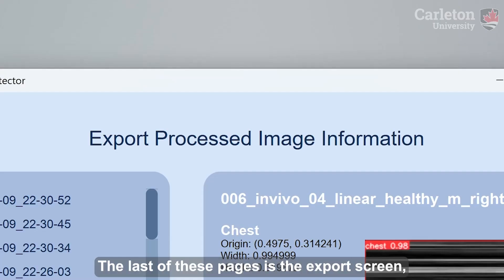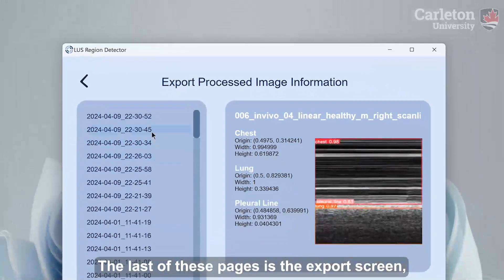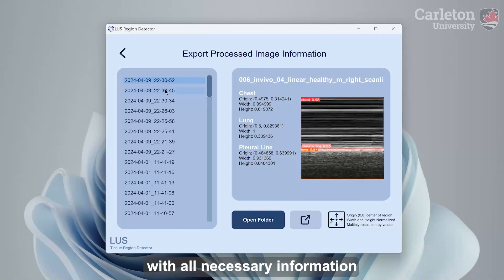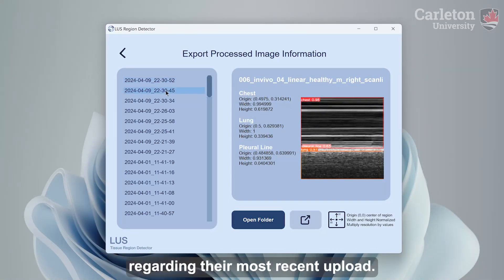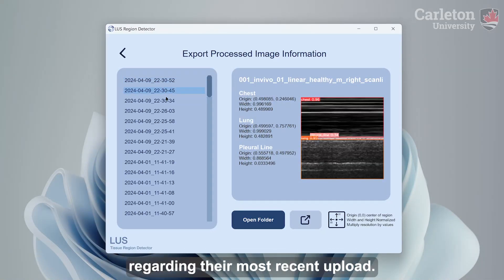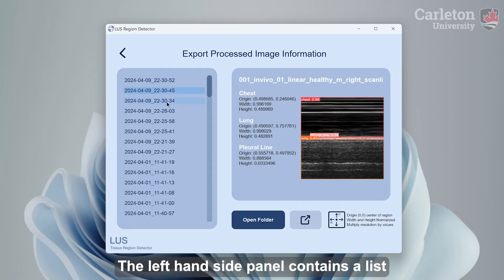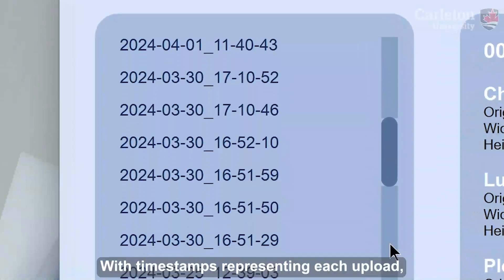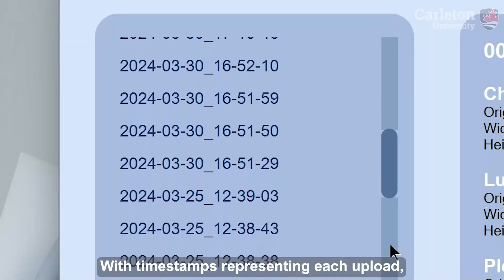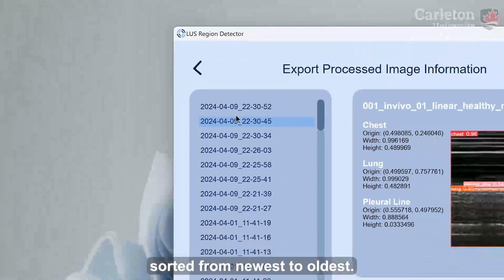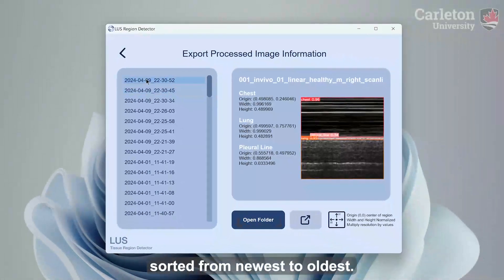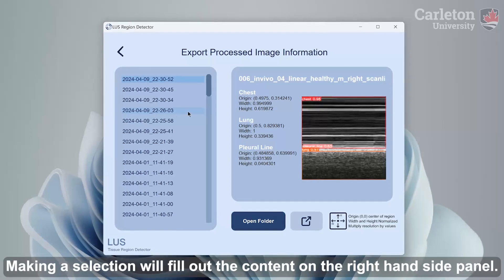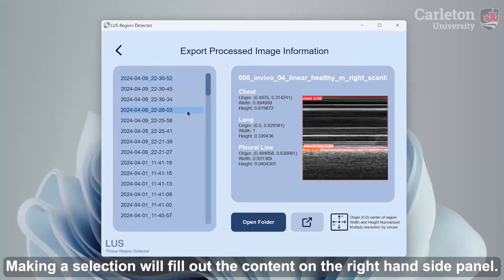The last of these pages is the export screen, which when entering will greet the user with all necessary information regarding their most recent upload. The left-hand side panel contains a list of all previous uploads to the app, with timestamps representing each upload, sorted from newest to oldest.